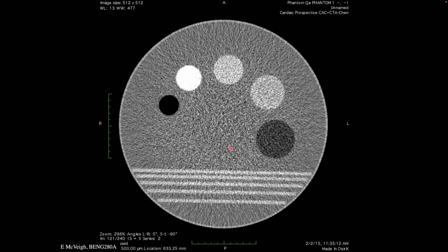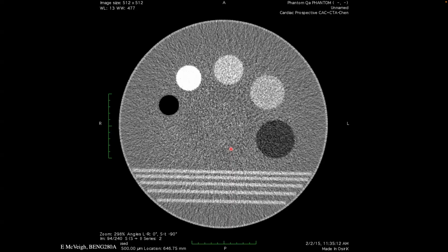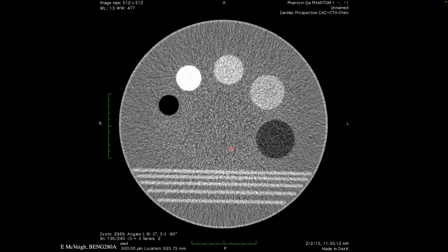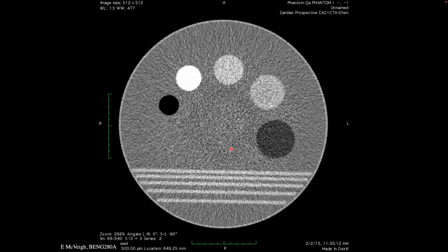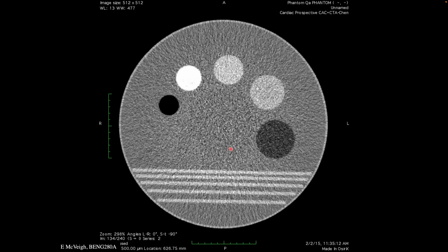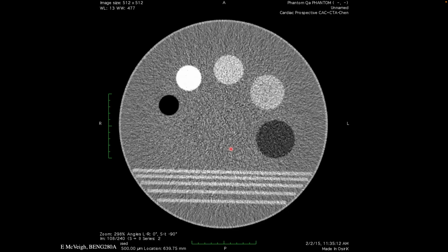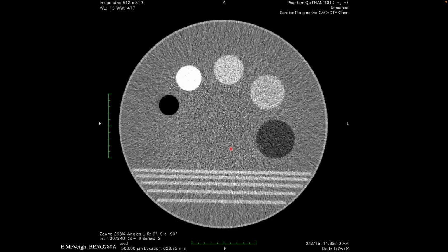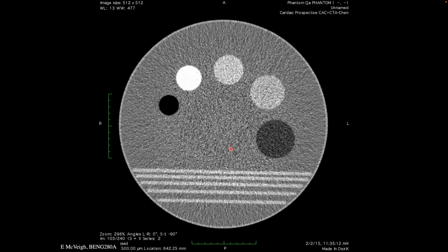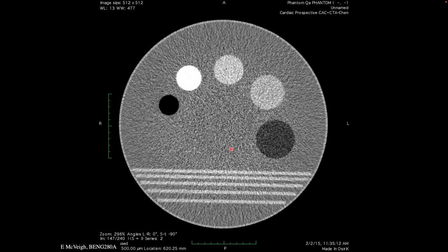Can you expand a little bit more on why that's okay? Because the better part of the image is the one with more noise. That's right, it's a very good point. The better part of the image often means you have higher frequencies available to reconstruct the object in that location without some artifactual spray coming off of the object.